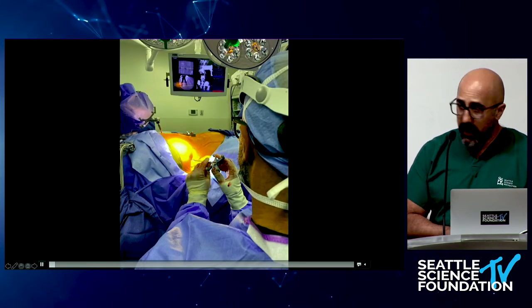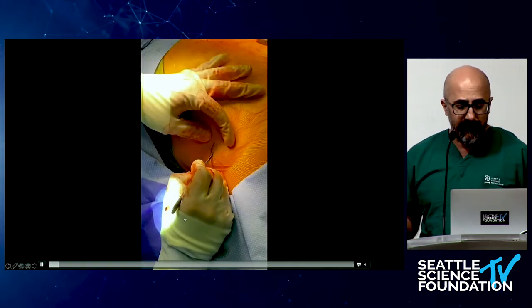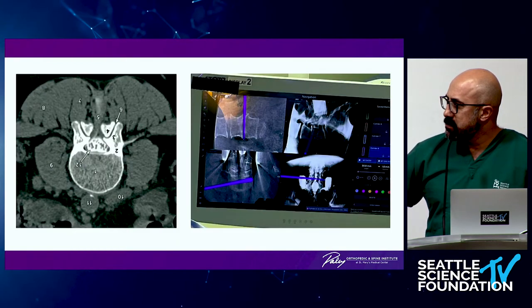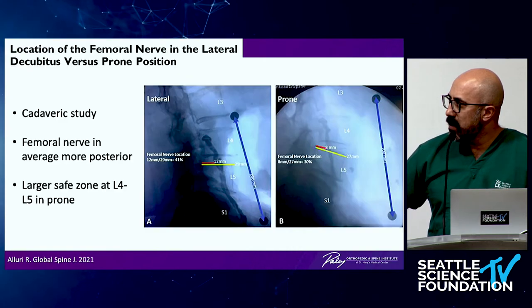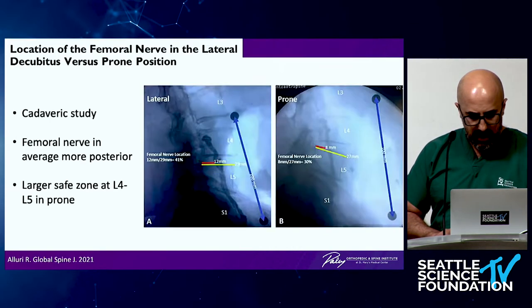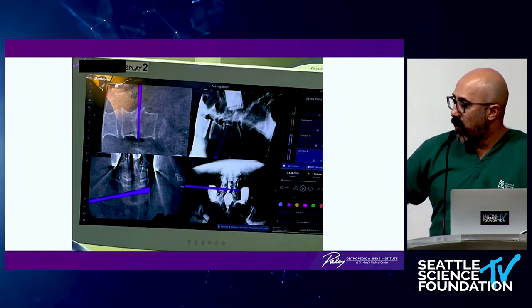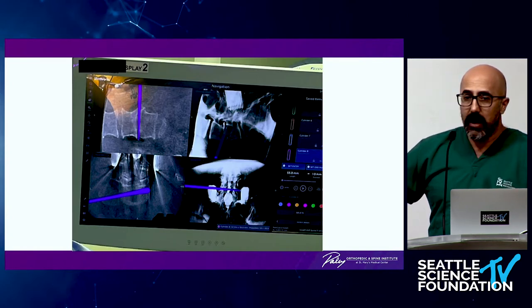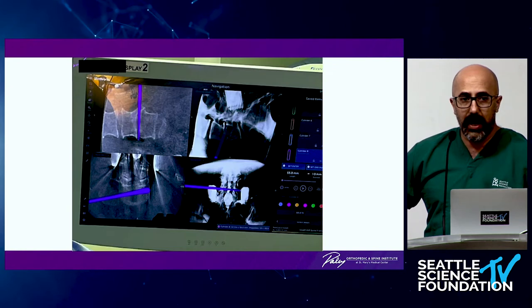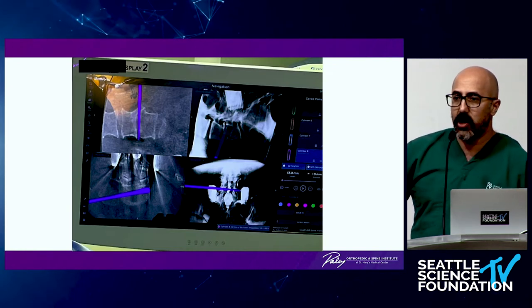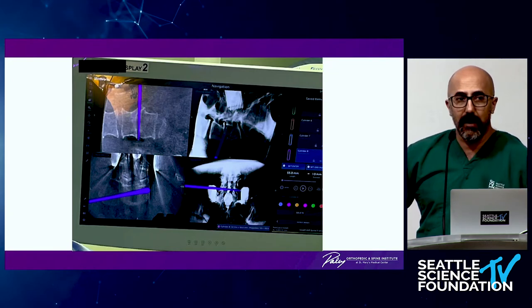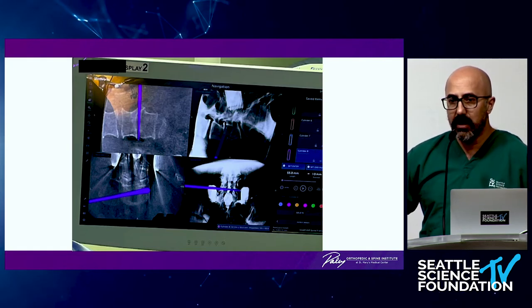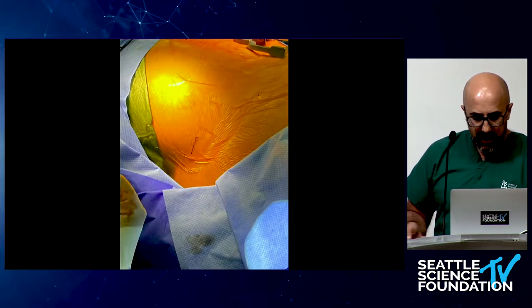Here's the workflow video. I always have four images up when I use navigation: the axial CT, the coronal CT, and also a synthetic AP and synthetic lateral — always up at all times. That's an extra set of orientation so I'm not driving into the end plate. All four images are always up when I utilize navigation, and it does a good job of protecting you.